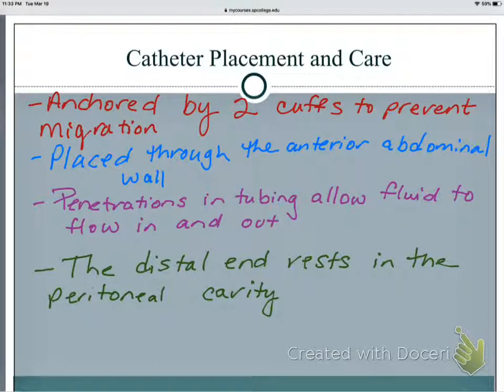Okay, so for preparation, what we do is we empty our bladder and bowel. These are just nice to knows. You, of course, get consent because it's a surgical procedure. And with any dialysis, before you start a dialysis treatment, you should always get a weight. Good, weight, very good. That's how the nephrologists know how much fluid to take off or how much to exchange, okay?